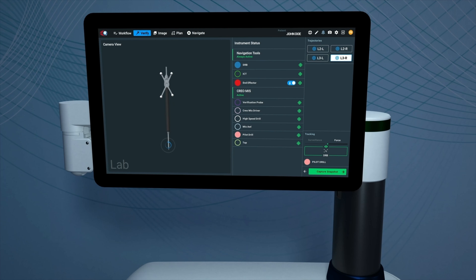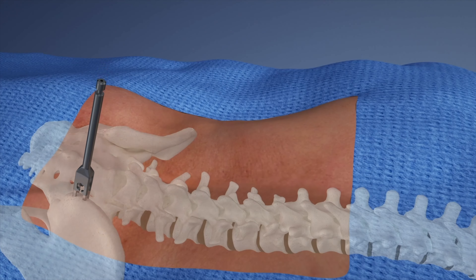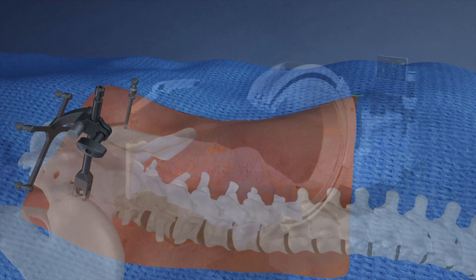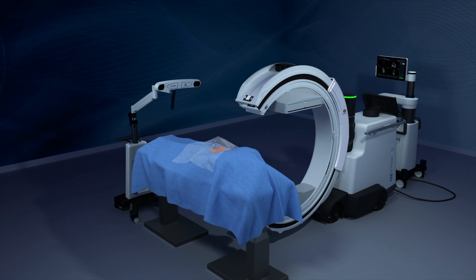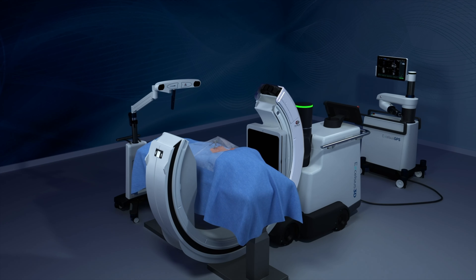The integrated navigation instruments are then verified. After verification, the patient is prepped for intraoperative imaging. The patient array and surveillance marker are placed, and are constantly tracked to detect if the patient or table shifts during the procedure.